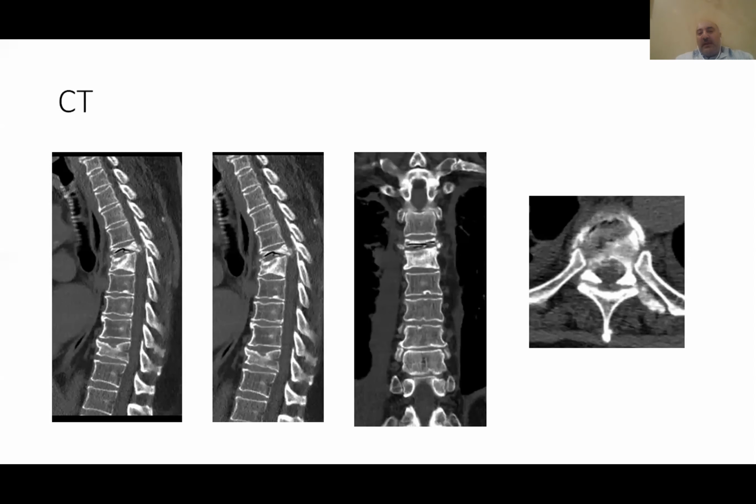That was really a challenge. Shall I fill the vertebra or just do decompression? Because decompression alone is going to lead to instability. And you can see there are 2 levels here. It's broken. One is complete, the vertebra plana, and in the other, the upper end plate is broken. So in this situation, it was really a challenge. And this guy, I'm planning to go only one shot and just clear. So I did minimal invasive.